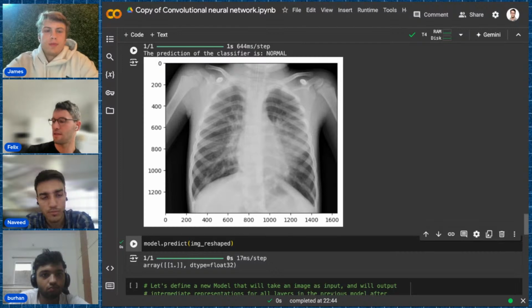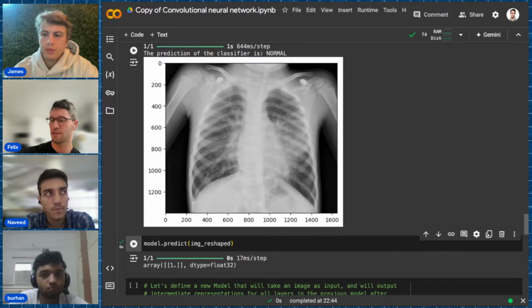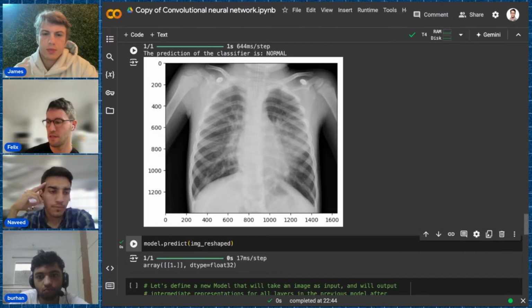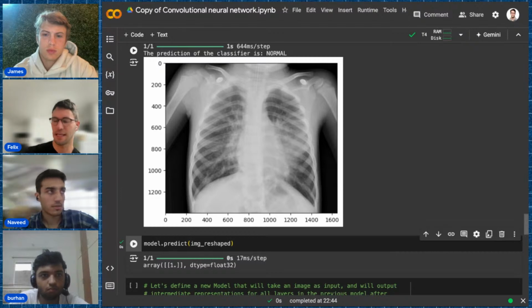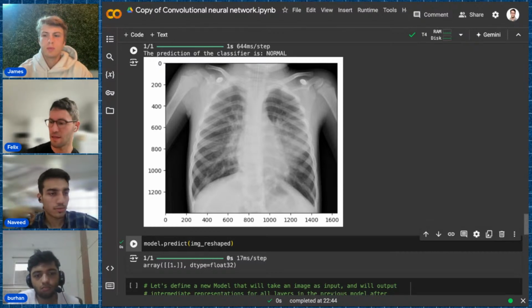What I don't understand is that in the training set it predicted 100% accurately, and even in the other set it's 87%, which is not bad, right? I think above 70% there's some signal, at least in the noise.